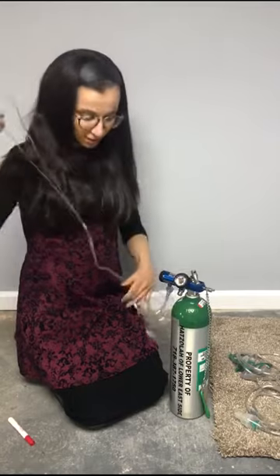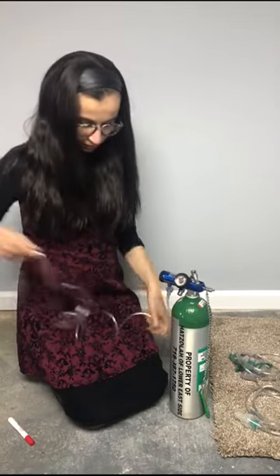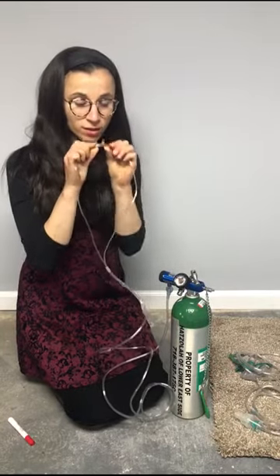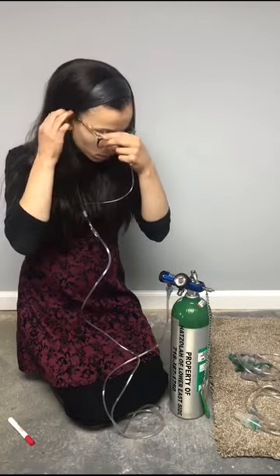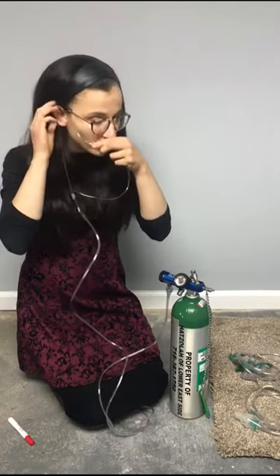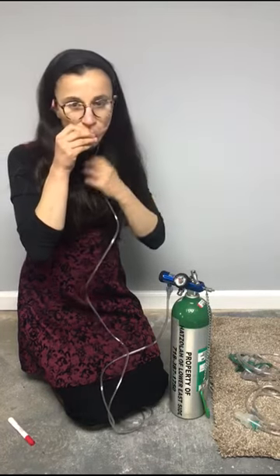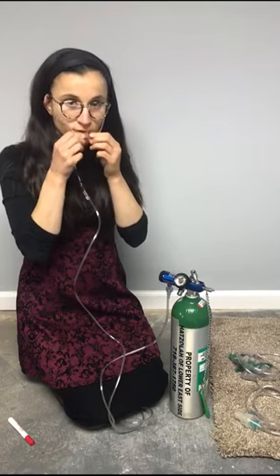So this is your nasal cannula. It's long tubing. Over here are the nose pieces. Each one goes into one of the nostrils. It goes in the nostrils, around the ear, and then it gets tied over here, closer to the neck. You're going to tie it, but just make it a little closer so it stays in.